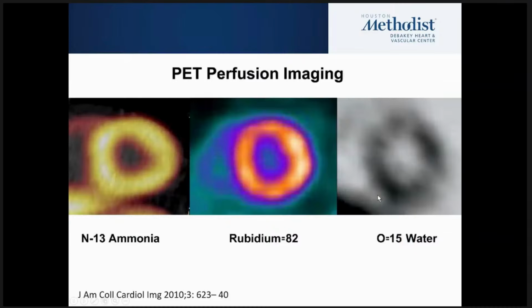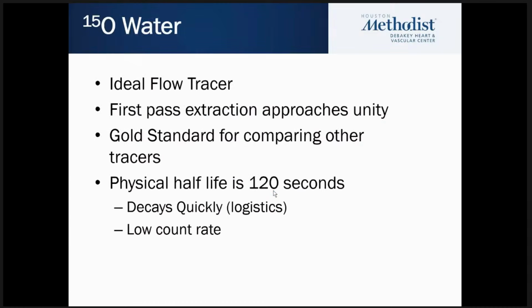Its first pass extraction is almost 100%, and it is the gold standard for comparing other tracers. So everybody wants to compare their flow data to O15 water.